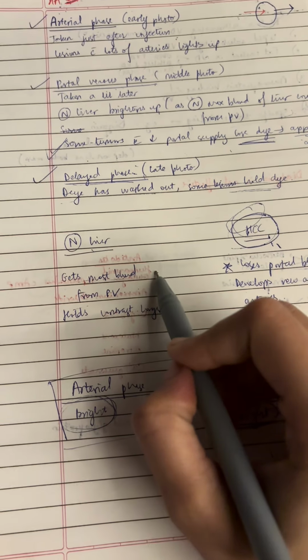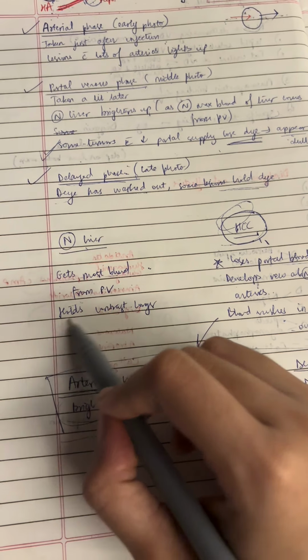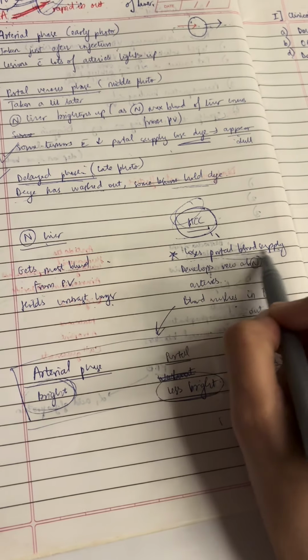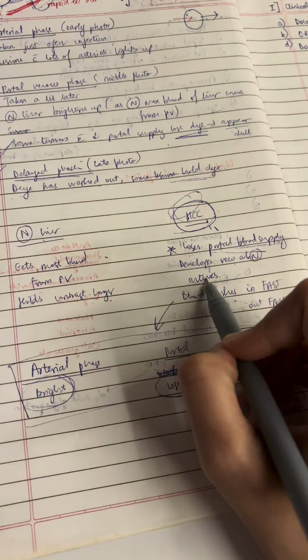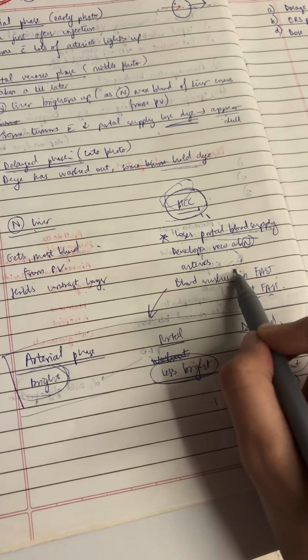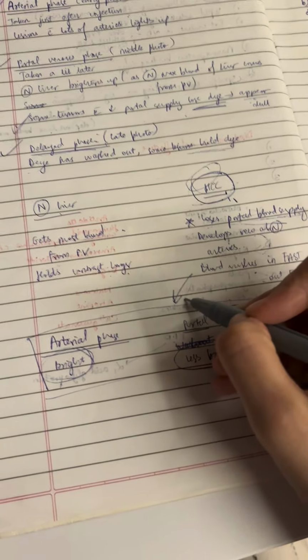The normal liver gets most of the blood from the portal vein, right? So it holds its contrast for a longer time. But what happens in a HCC? It loses its portal supply. This is very important, okay? And it develops new abnormal arteries. So blood will rush in fast and it'll rush out fast because of the new arteries, right? Vascularization of a tumor. So how will it look on a triple CT scan?